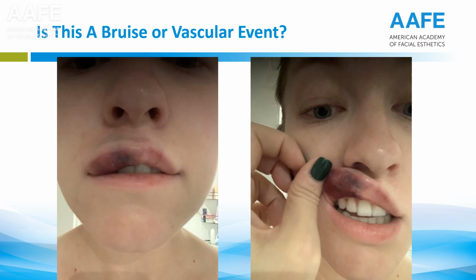But if it is a vascular occlusion or a compression, I can do an amazing guided injection on the patient using ultrasound, so I don't have to flood it with hyaluronidase, which is a big mistake for many, many patients. You don't necessarily have to flood anything with hyaluronidase if you have an ultrasound. That's a huge thing. Ultrasound guided injections of hyaluronidase is absolutely fantastic.